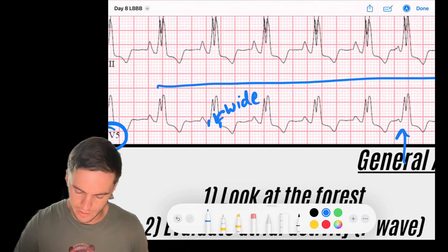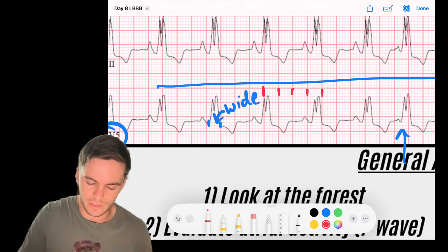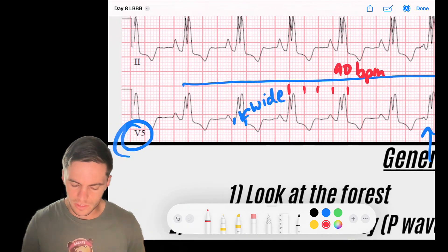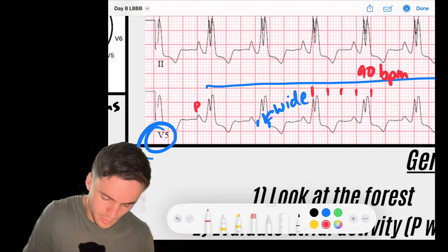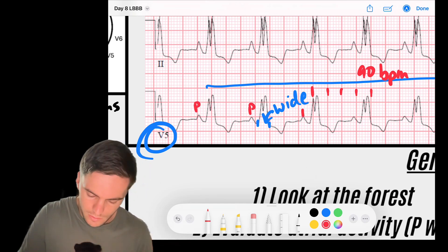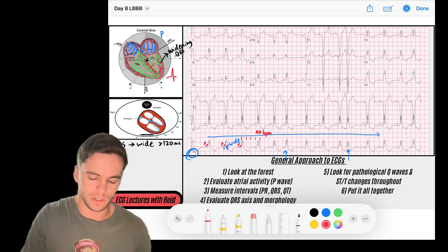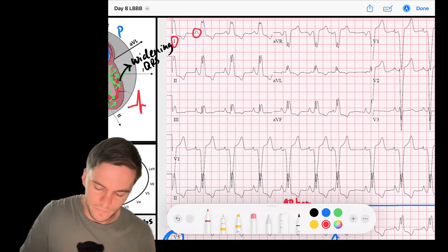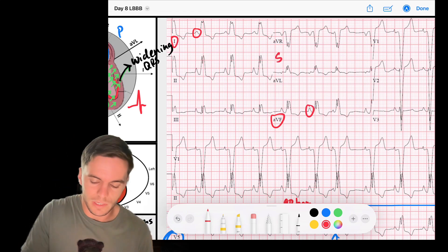And this wide complex rhythm is occurring at a rate of roughly, say this QRS lands here, 300, 150, 100, 75, somewhere between 75 and 100. I'm going to call this 90 beats per minute. So we have a wide complex QRS, and I noticed that before all of my wide complex QRSs, I have these P waves. So it seems like there are P waves that are driving this rhythm. So if I remember we evaluate our sinus P waves by looking for P waves that are upright in lead one and are upright in AVF. And that tells me that my P waves are going down to the left and that's a sinus P wave.